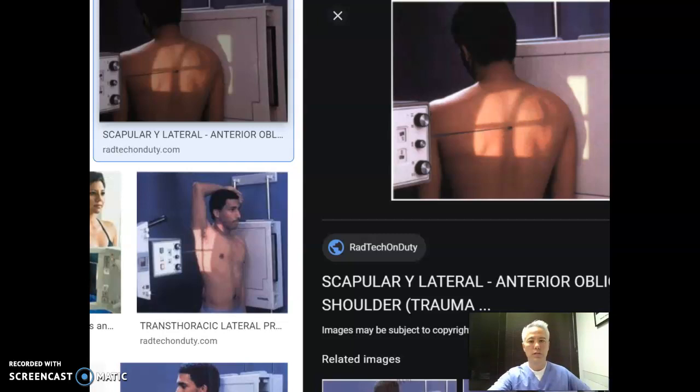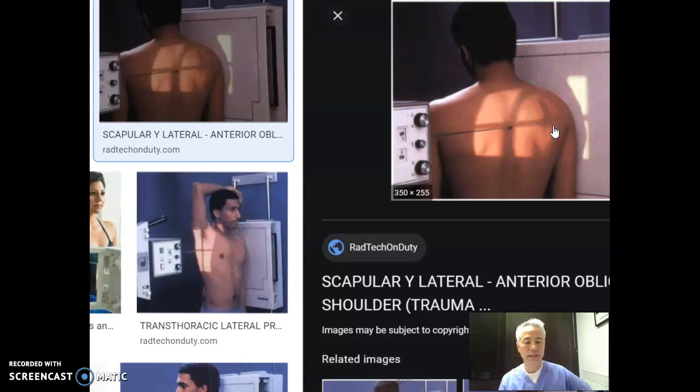This shows how the Y view looks — you're going to skim the body from the back side, so it's going to be in a PA position, either RAO or LAO. This one is showing a true Y view with no angle. The outlet view has a 15-degree angle going down, which just pushes the head of the humerus down a little bit more into the Y space, but it's basically the same position.